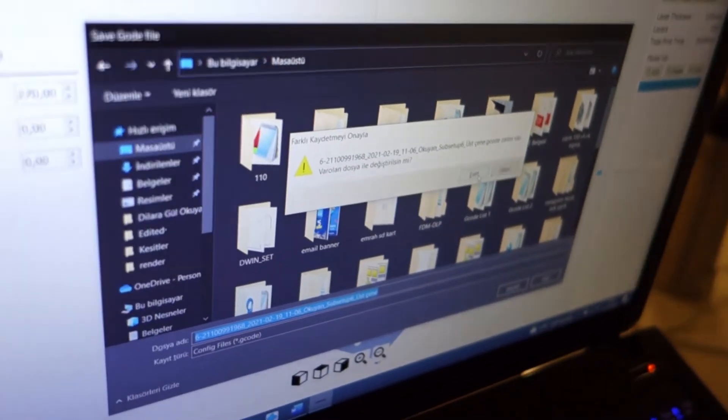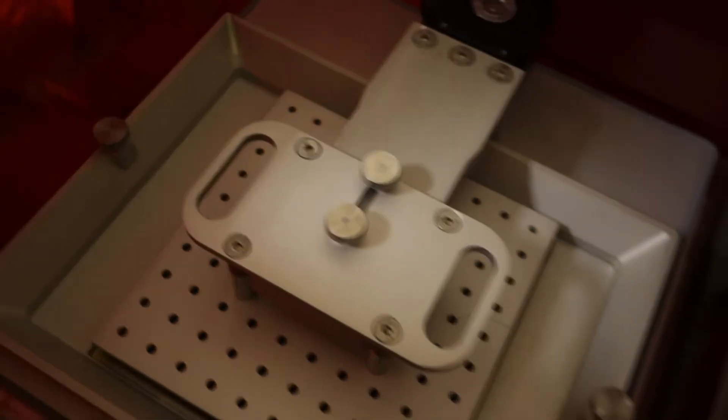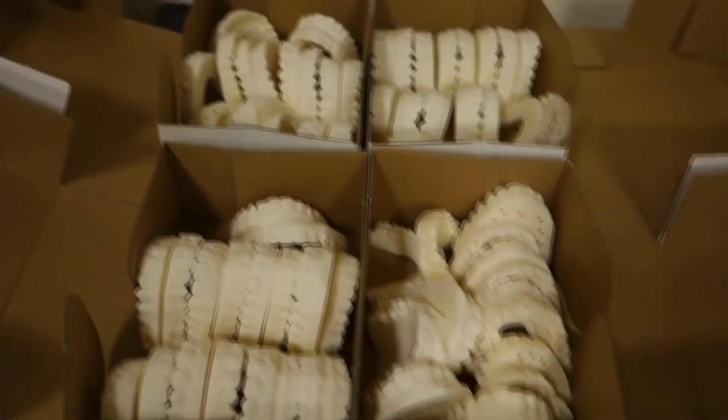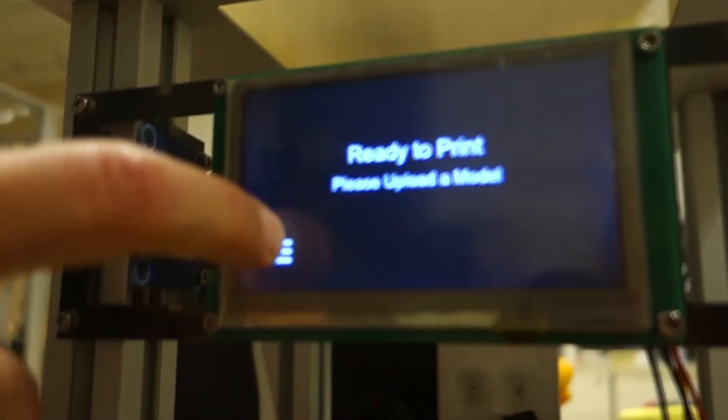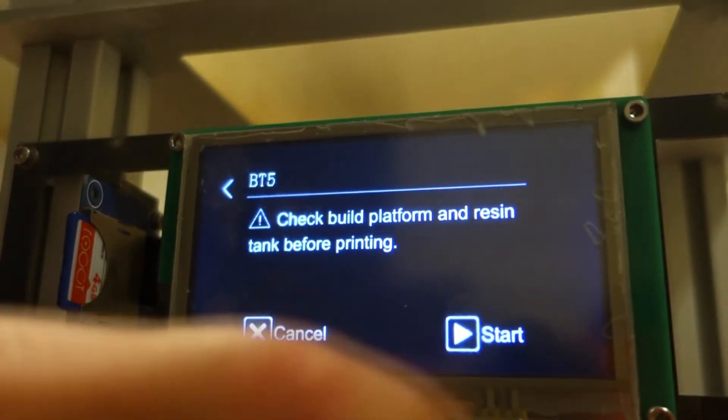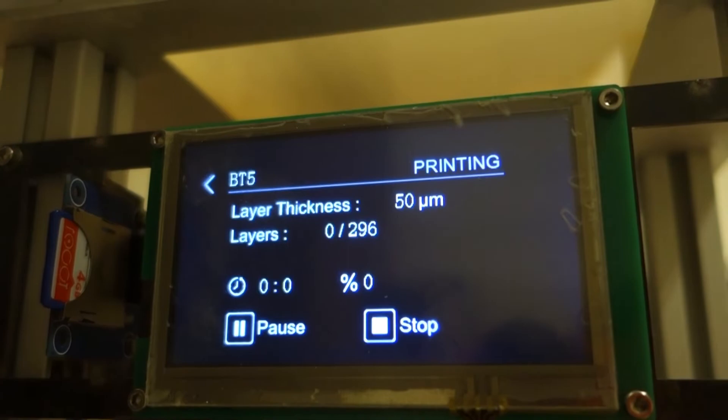Here's a sneak peek of our 3D printer — the Masita Dent — which is specifically made for this process. The resin we use is also specifically for clear aligner treatment. We'll definitely have a dedicated video about our 3D printers, but for now I just wanted to show you the printer we're using. After we insert the SD card with the model sliced and uploaded, we get the process started.